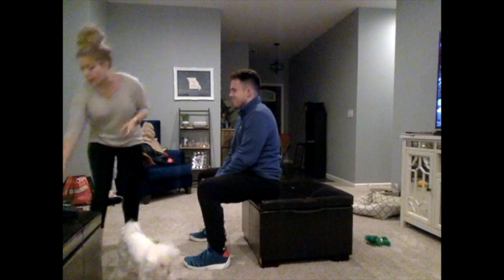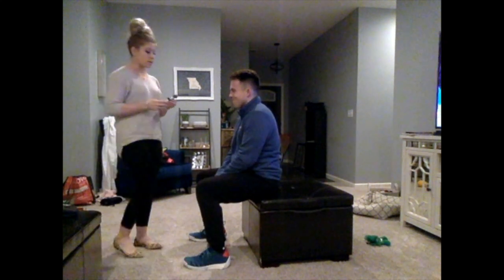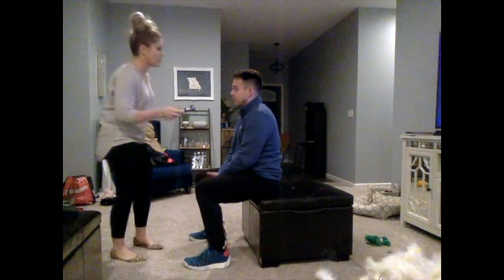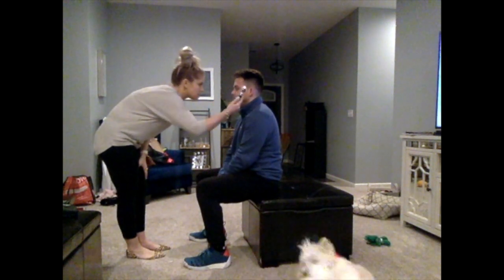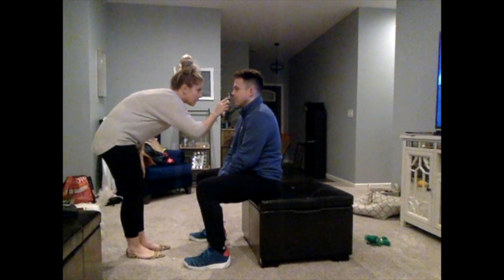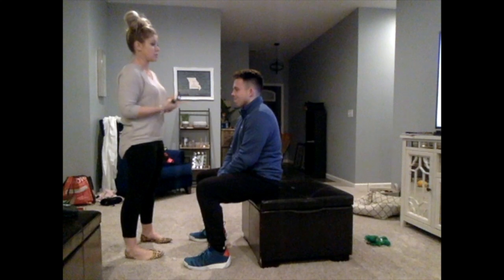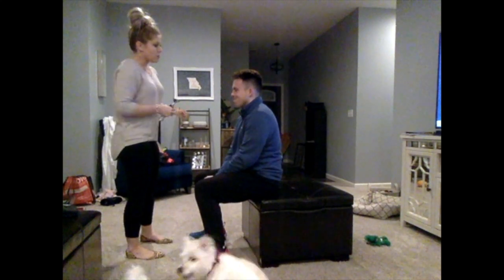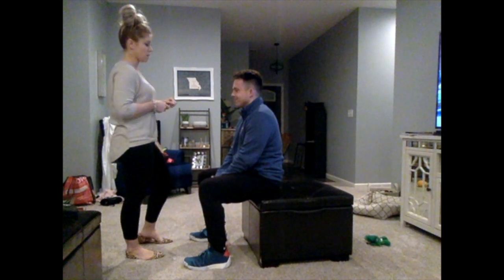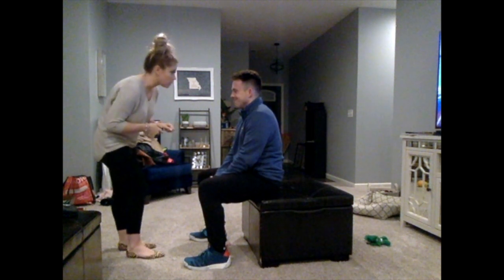So now I'm going to grab my light source, and I'm using my otoscope. I'm just shining this onto the side, looking for any foreign bodies in the eye. And as I go back and forth, I'm also looking at the symmetry. Now I'm going to be checking his pupillary response, looking to see if they're equally round and reactive to light.